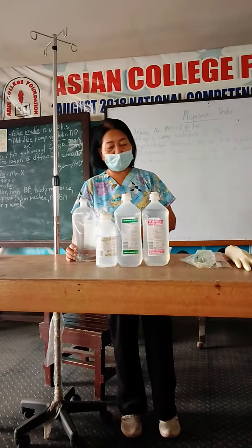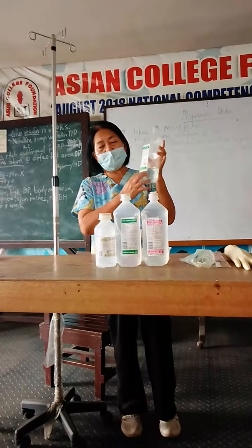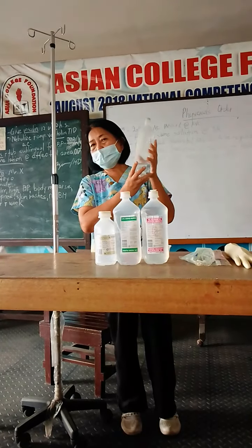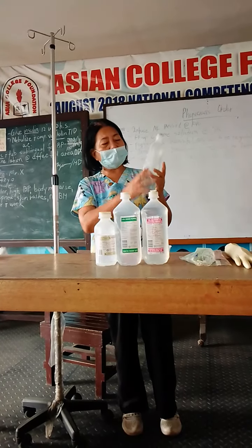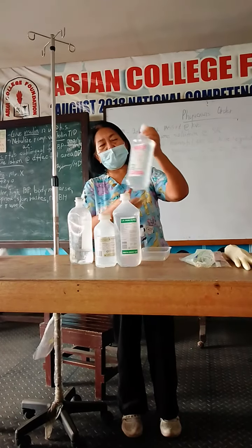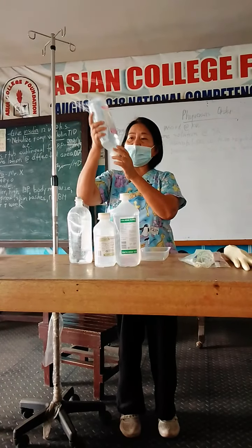And then we have to check the solution. What are you going to check here? The ordered solution, for any discoloration, the presence of any sediment, and also check the integrity. If it is closed, of course, we have to turn it upside down and check for any leaking.